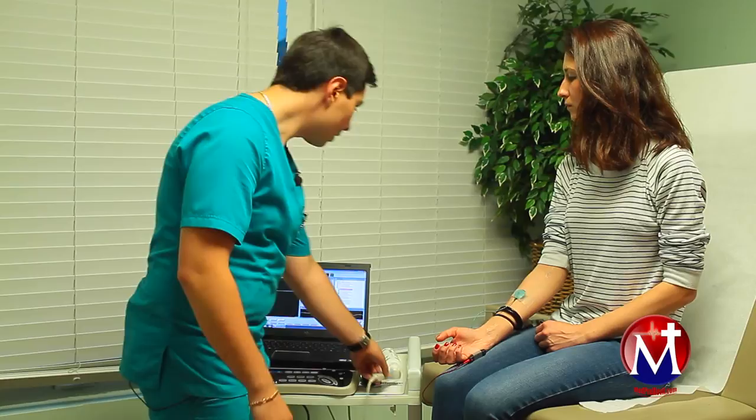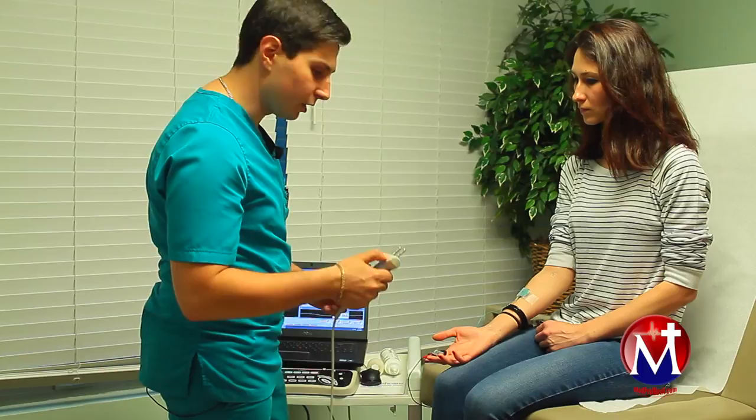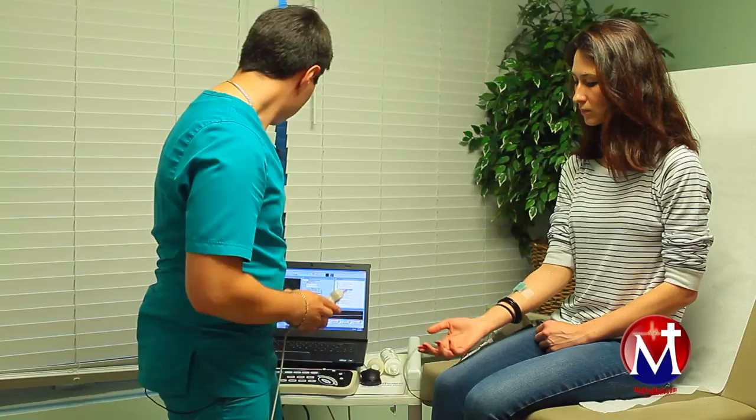Now we're going to check the sensory nerves. We will start from the median sensory. Place the electrode on the second digit and apply stimulation to the wrist. We also have normal latencies, amplitudes, and conduction velocity.